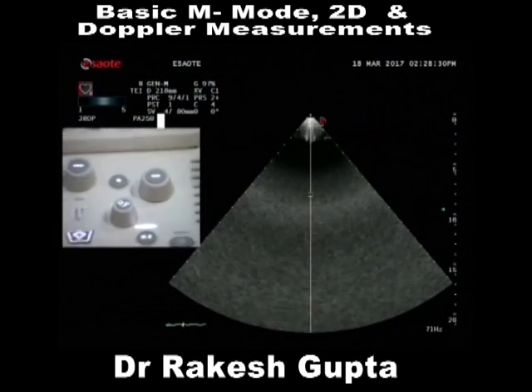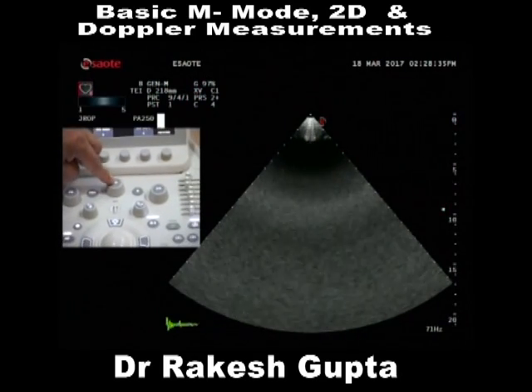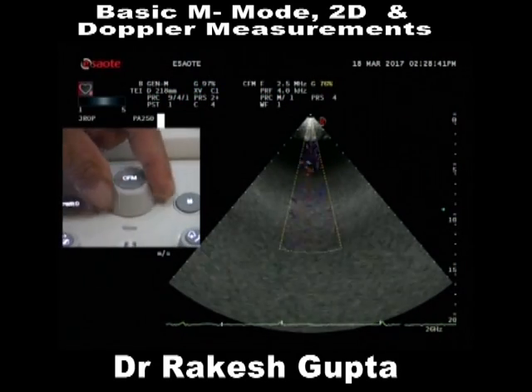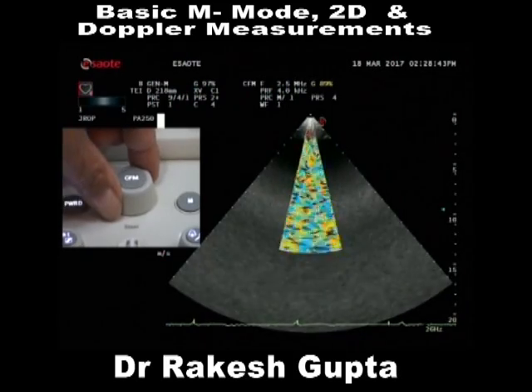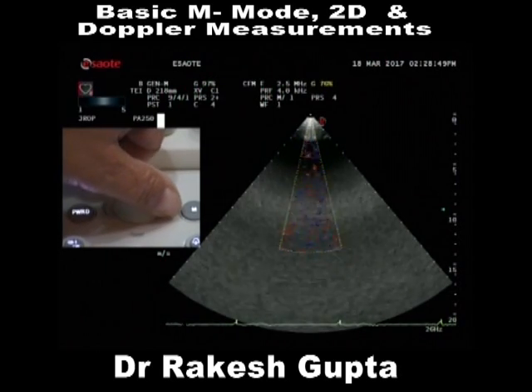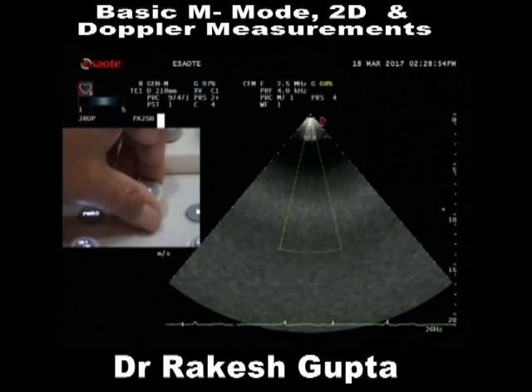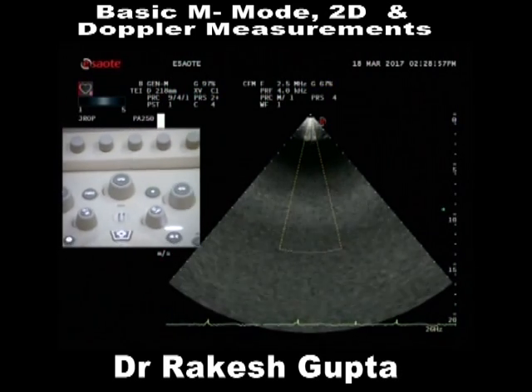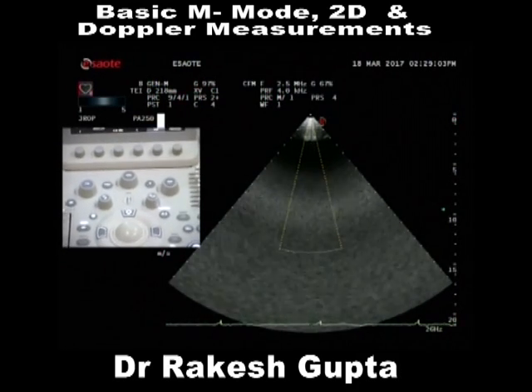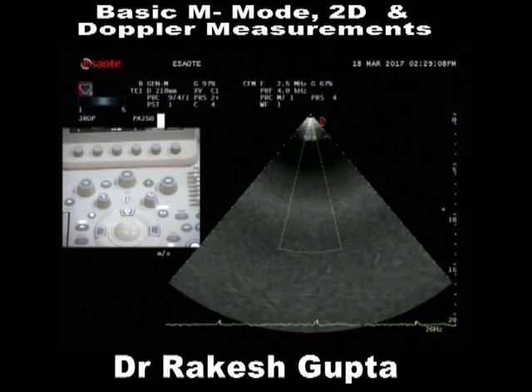Parashar sir must have told you another thing, color gain. How do you know this is the color gain button? I have switched on my colors. Now I am increasing my colors. So these are all jumbled up. How do you do gain optimization? Now I am reducing my colors. When hardly any speckles are seen, that means it's the optimization of color gain. Otherwise, if I reduce my color gain substantially, I may not be able to see color jets. Clear?